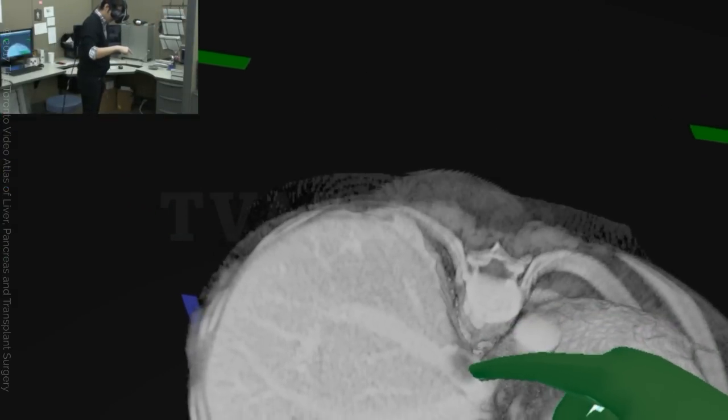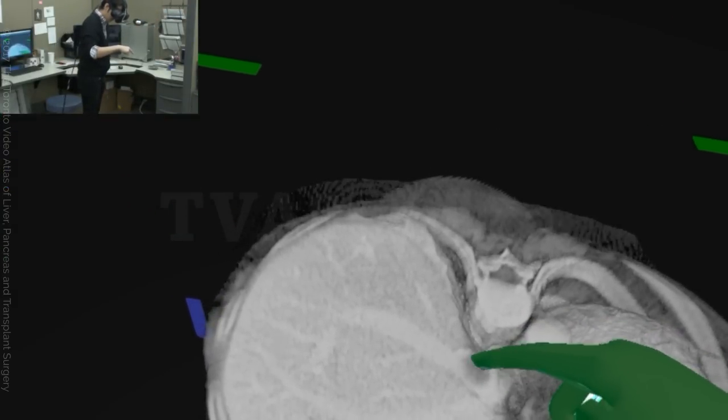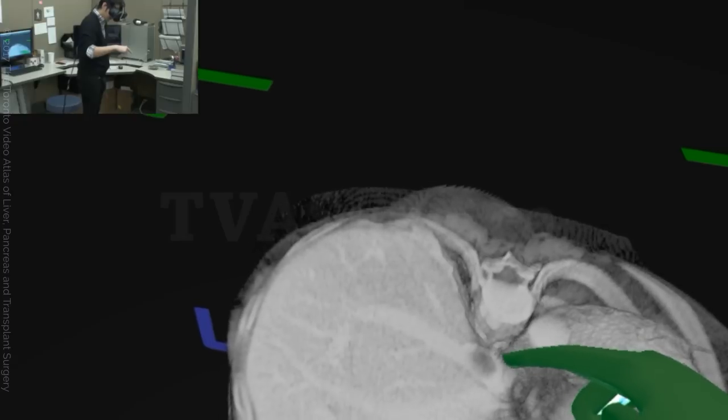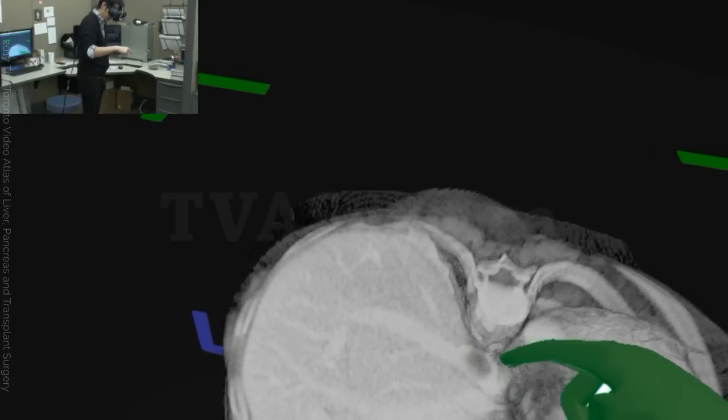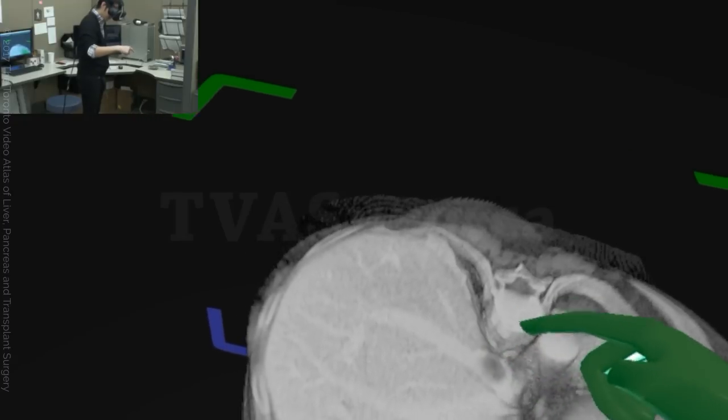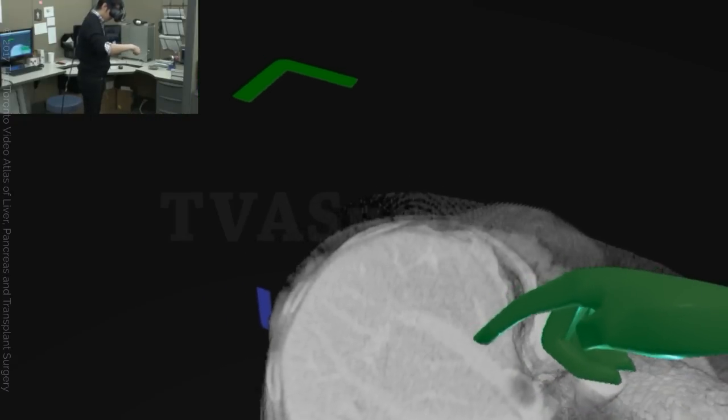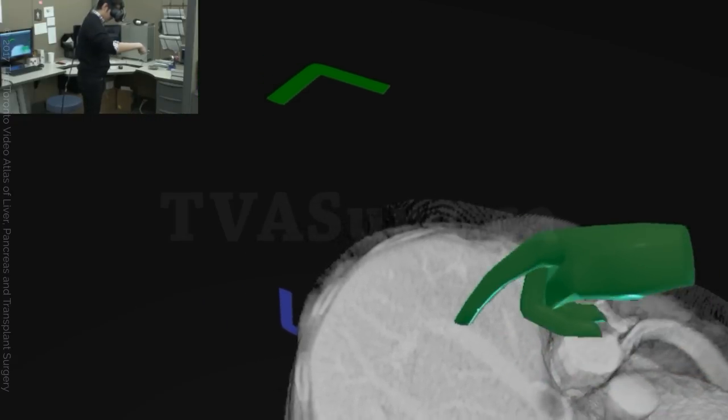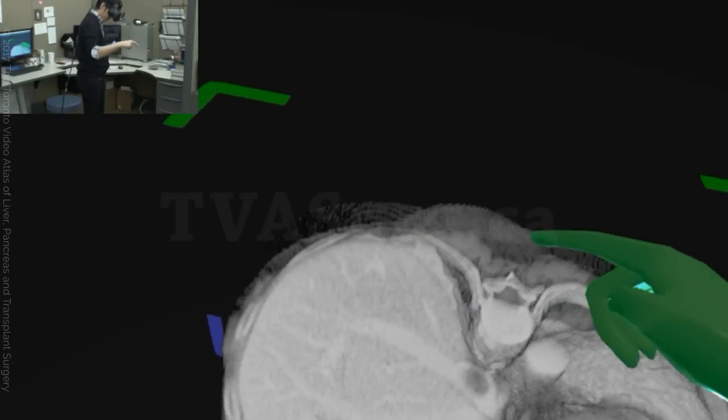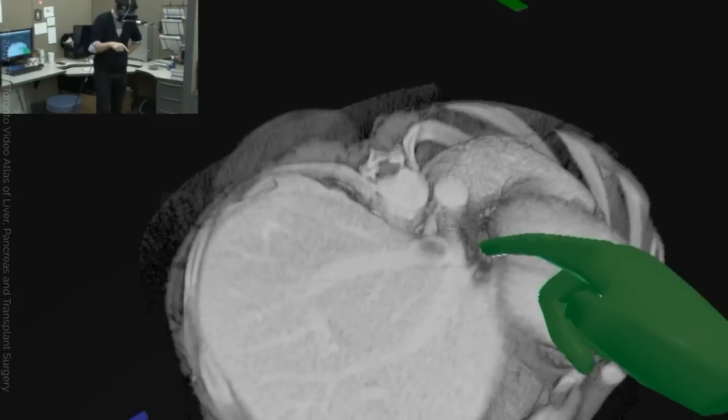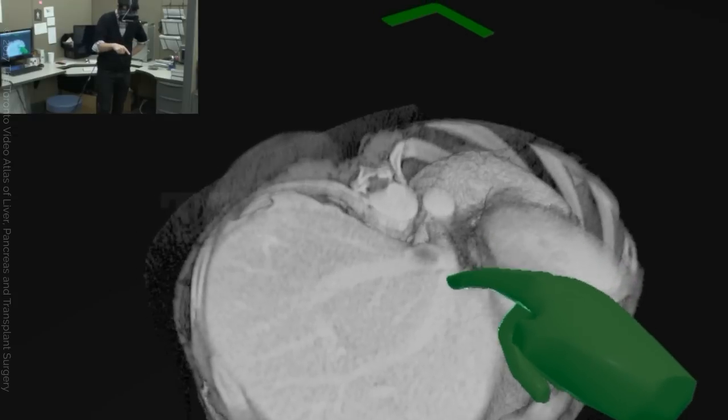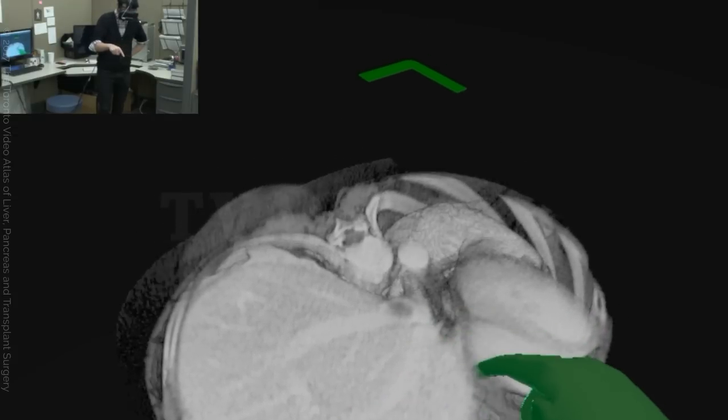It is right in the middle lumen of the vena cava. You can also see how close it is to the right hepatic vein here, and the middle and left hepatic vein confluence.